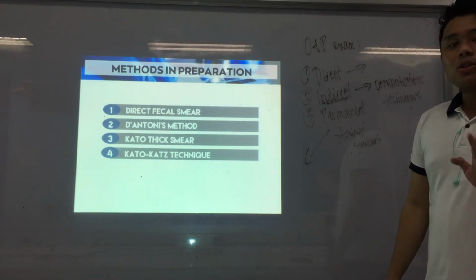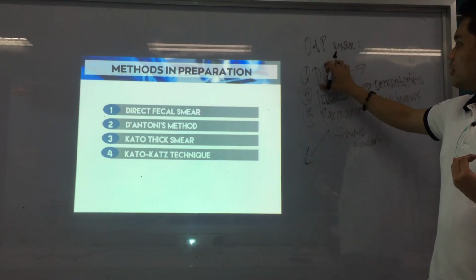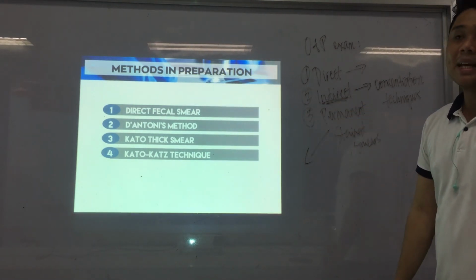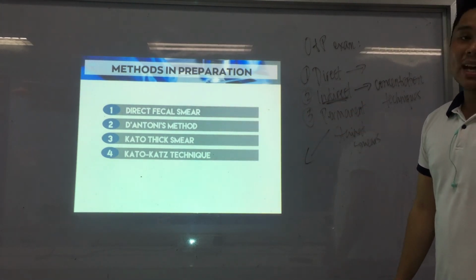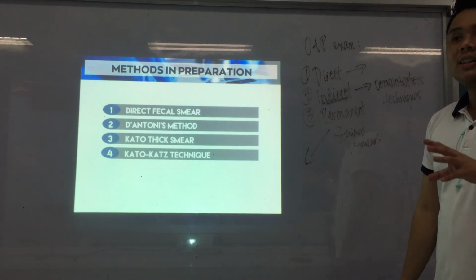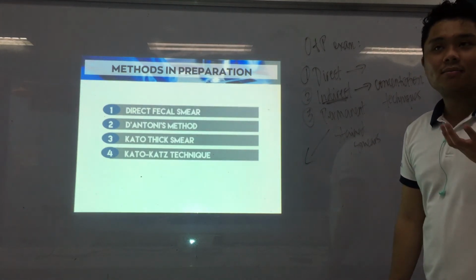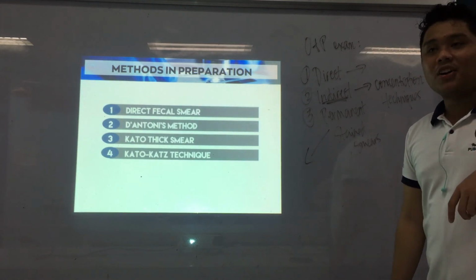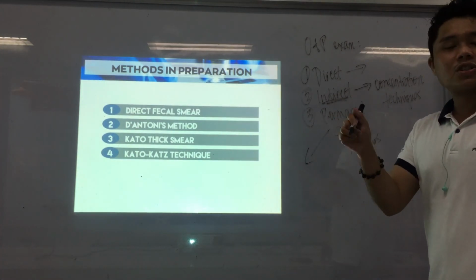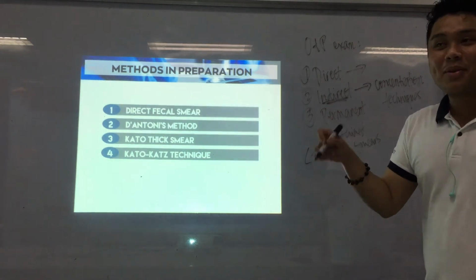Most laboratories outside of the country don't perform the direct wet mount, like the direct fecal smear, because it's not that accurate or not that sensitive. You cannot examine everything, or you cannot usually get the parasite from your specimen, because it varies from one examiner to another.